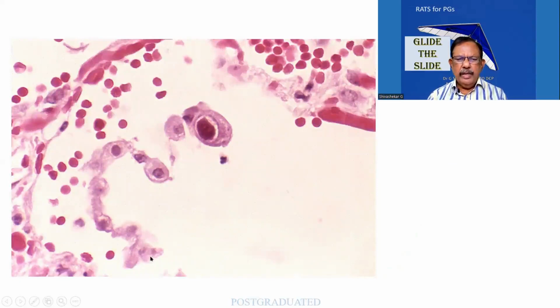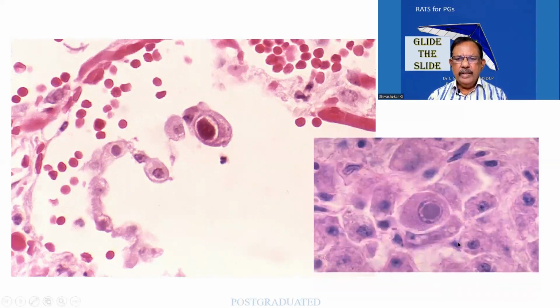I am finding prominent endothelial cells and then there are the RBCs. It can be anywhere, highly vascular or even an alveolus. Leave alone the tissue. I am able to see again a large cell, large vesicular nucleus, prominent eosinophilic nucleolus. Classical. If you're not convinced again, look at this one. And this tissue, I hope you are able to identify. I'm finding polygonal cells in radiating cords. It's a liver in which there is one cell showing a viral inclusion within the nucleus.